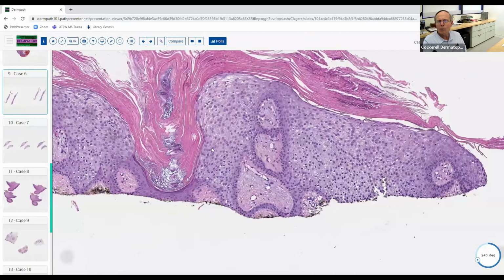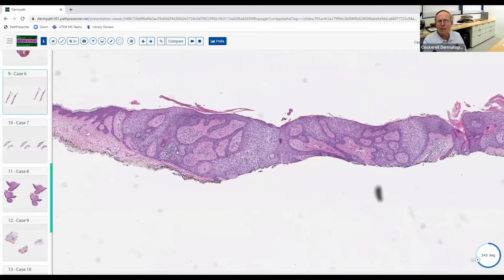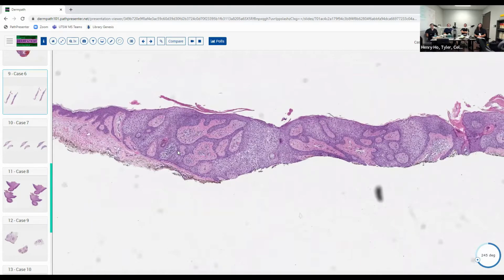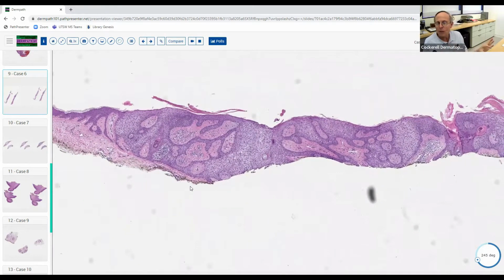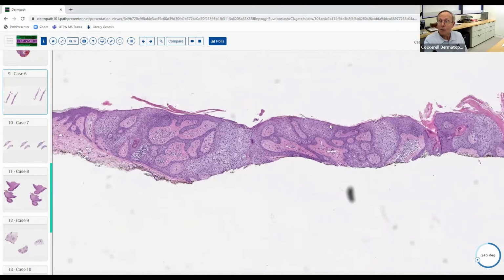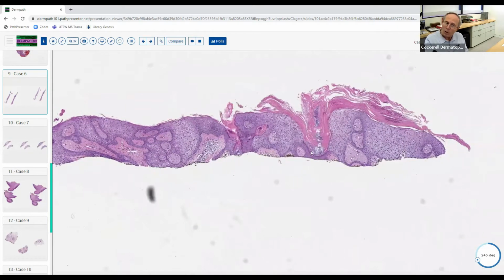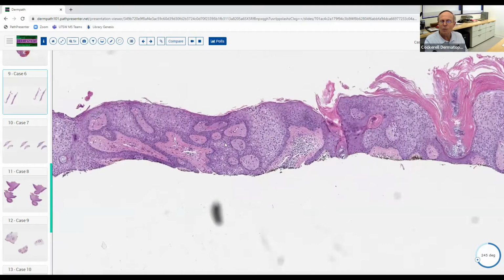And then you ask, is there anything else that's more specific for this? If you see a clear cell acanthoma, it kind of looks a little bit like this, but if you look at the architecture, it looks psoriasiform, with very regular, elongated epidermal rete ridges. What's the orientation of this lesion? It's not psoriasiform. It's kind of horizontal, right? You appreciate that? It's a horizontally oriented lesion with little reticulated small aggregations of cells that form a network-like reticulated pattern.